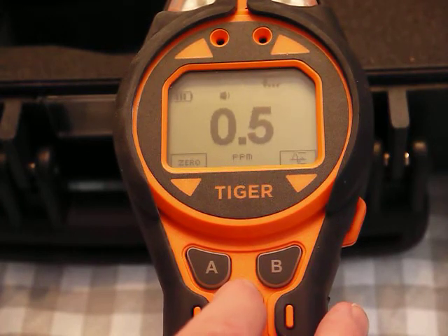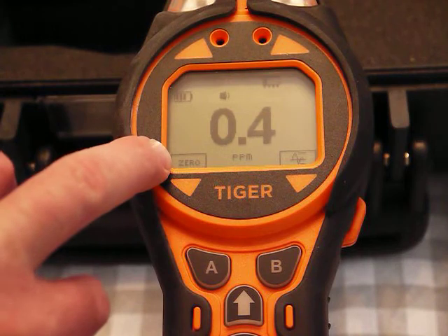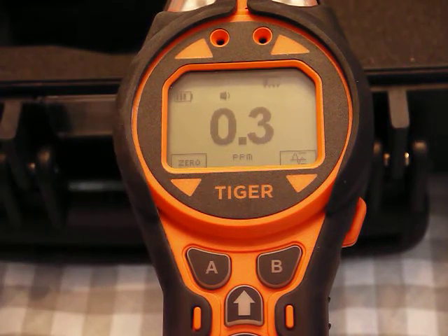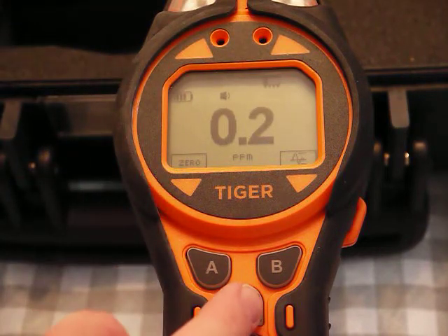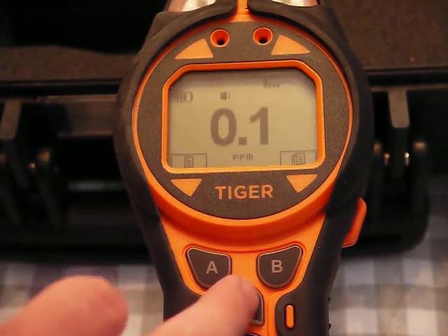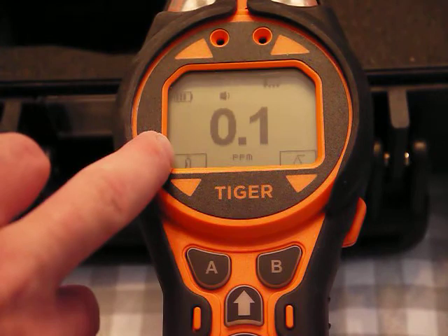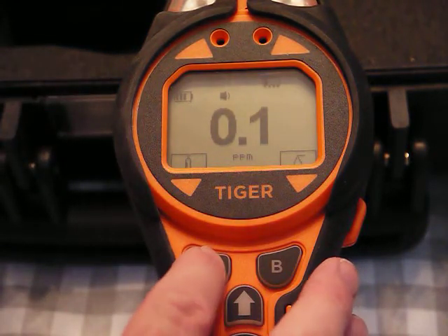This is calibrated with isobutylene, which is the standard gas to use. There's also a feature to zero out the background if you're in a super clean area with no background VOCs — though it's not a big deal to have a bit of VOCs in the background. I'll look for the cylinder of gas icon.